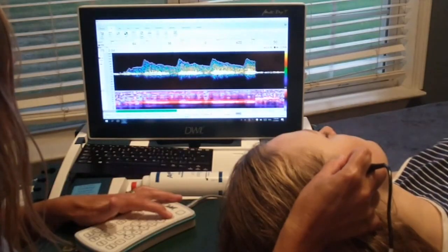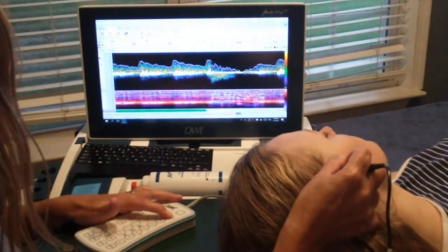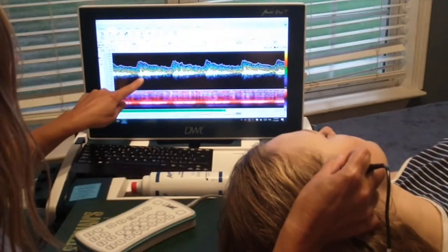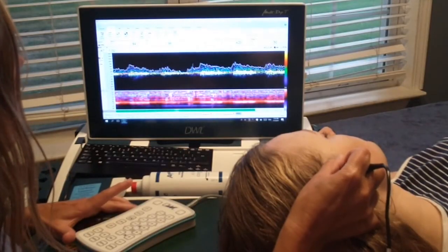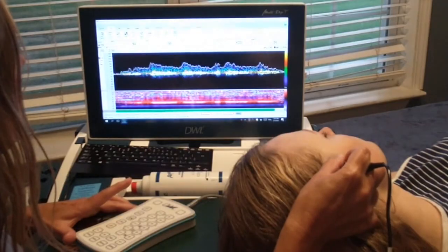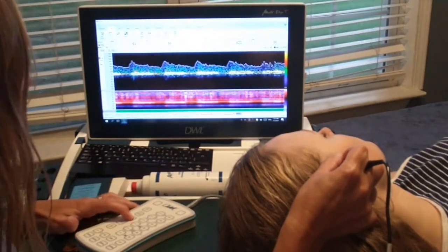As you start angling inferiorly, watching the ACA, the blue, vanish on M mode and below the baseline. What you will want to do is angle inferiorly towards the chin and then come up slightly in what's called the J maneuver. When you have an optimal distal ICA, you will save a picture.